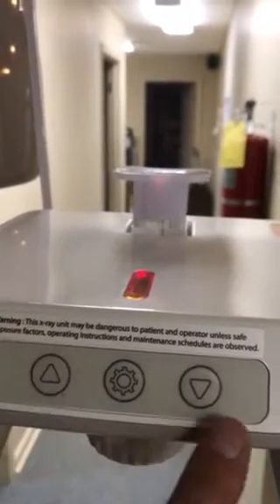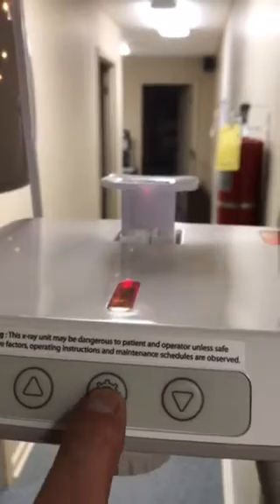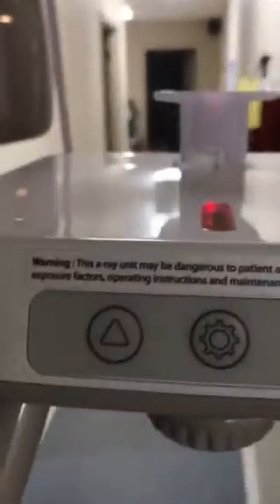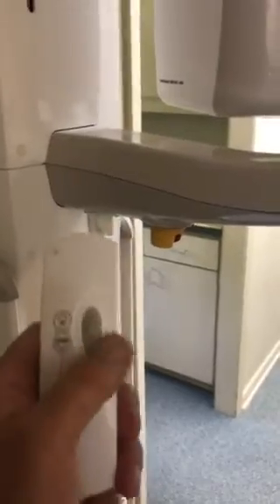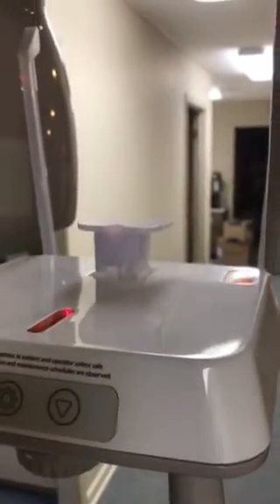Now I did miss a step earlier. When you bring in the patient, you can raise or lower the pan to the height by using these buttons. This button here will turn the lights on and off. Okay, this holder here also does the same thing those two buttons do, by raising and lowering the pan, and it's over here on the side of the pan, but most people just use this right here. Okay, we've got the patient in the machine and they are ready to take a pan.